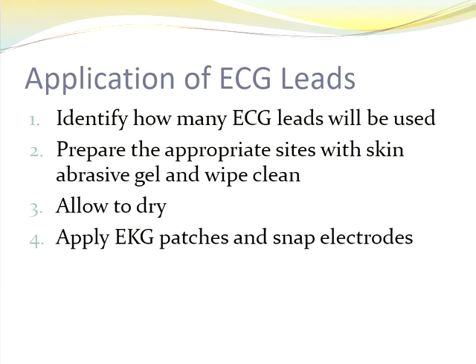Application, same thing, have how you've been applying. You can use the lemon prep for this. Just be a little more careful than you were on the legs, but you can use it. Up to you. Got to practice, see what works best for you. Clean the spot, dry it off, apply the snap stickers. I find having the stickers already attached to the lead is a lot easier to apply than putting the stickers on and then attaching the wire to the sticker itself after it's on the patient, but you'll figure that one out on your own as well.